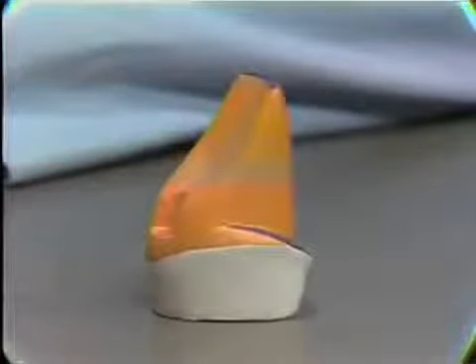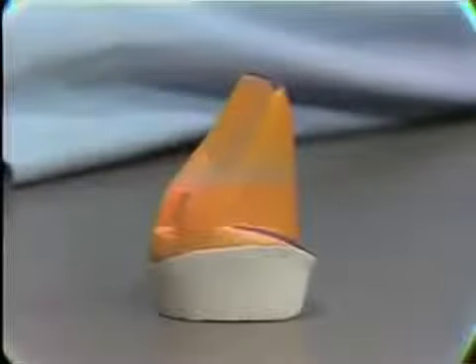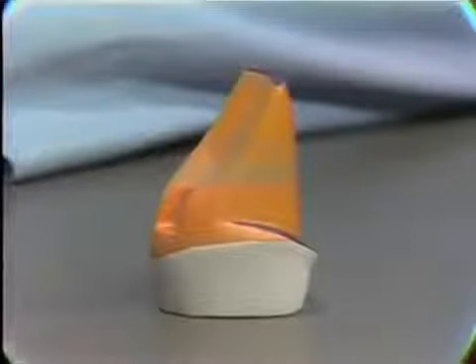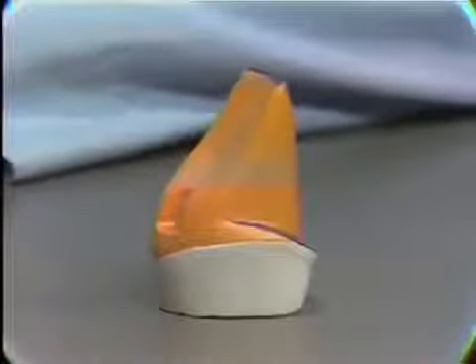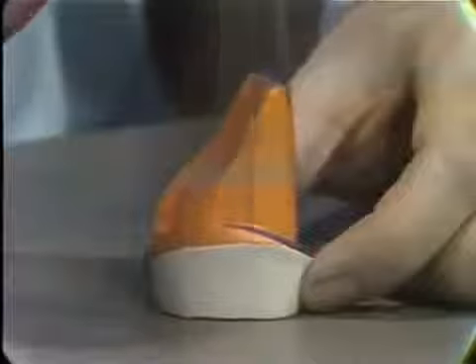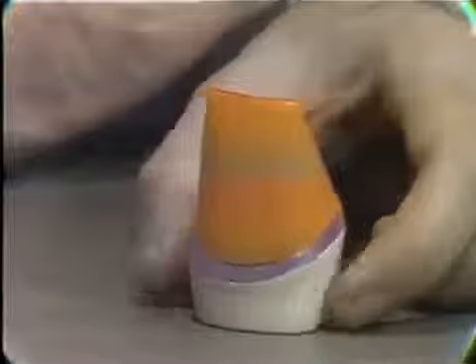The veneer crown retainer is used, of course, on both anterior and posterior teeth, wherever aesthetics is critical. And the particular model we have here is of a preparation on an anterior tooth, a maxillary incisor tooth. The complete crown preparation, which this is, of course, is one which gives maximum retention. As you can see, the areas involved in retention are at a maximum here. All of the axial surfaces of the preparation participate in retention and anti-torquing activity.